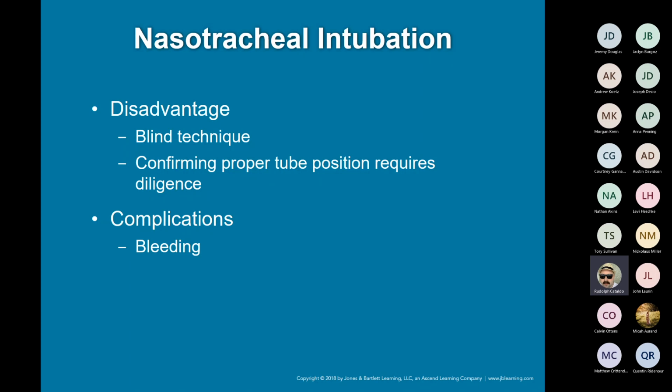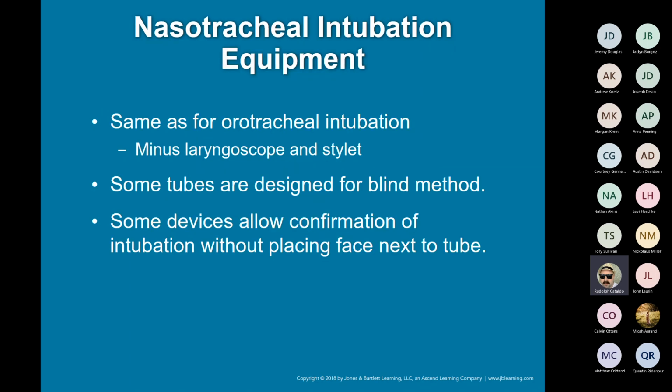The equipment's going to be very much the same. The only thing that might be a little bit different is you might have to, like I said, use a bougie with these patients because you're trying to preform how you want your endotracheal tube to be placed. A lot of times they'll also use a lot bigger tube, depending on the patient, I should say. The textbook will say slightly smaller, but I'm telling you, in real life, they'll usually use a larger tube.